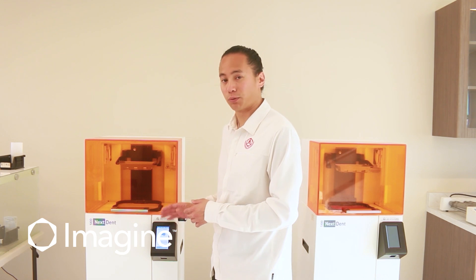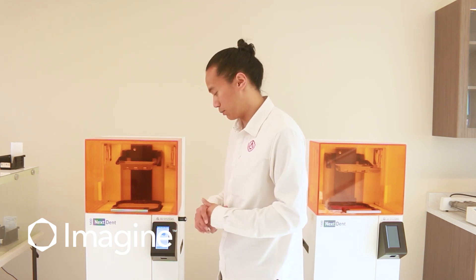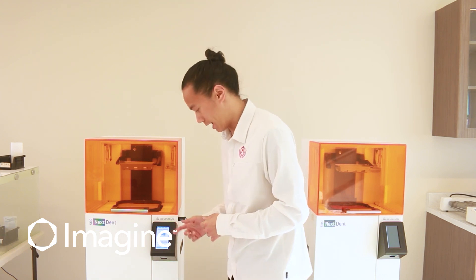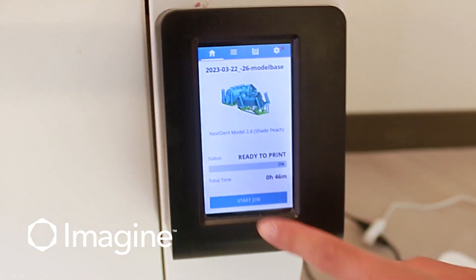You're going to see a little preview in the touch screen with what you're about to print. Here we're going to be printing our model bases, and I can see a little STL preview of those bases on the screen. The first thing we're going to do is click start job.